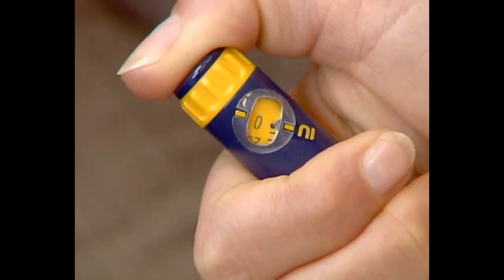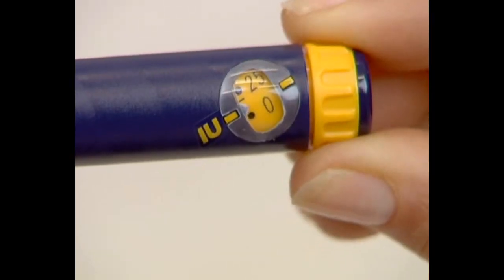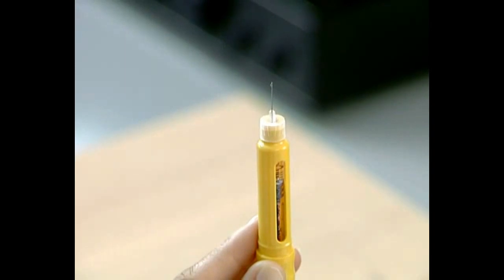If no droplet appears, simply follow the previously described step by dialing the dosage knob one click and pushing in the injection button until a droplet appears. See the chapter, Preparing for your Injection.